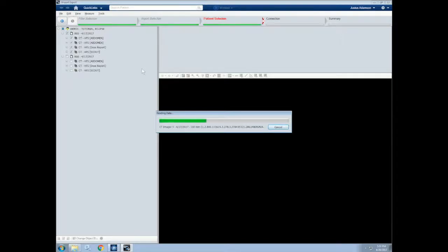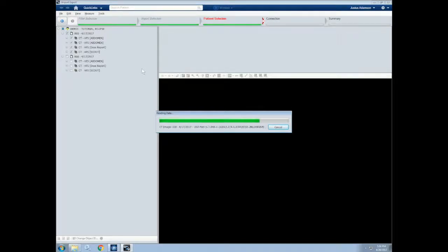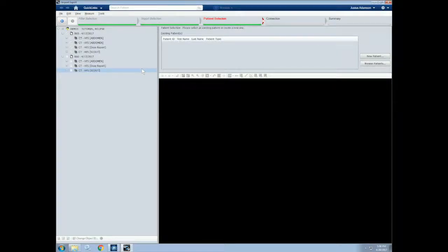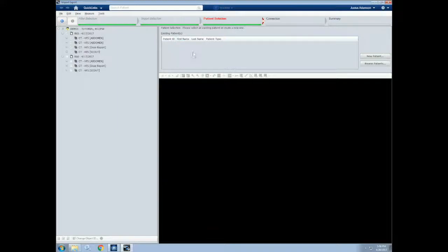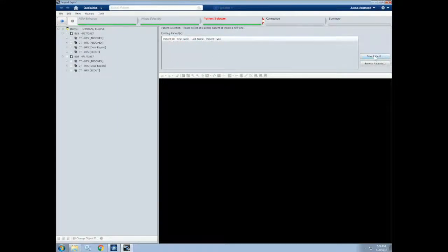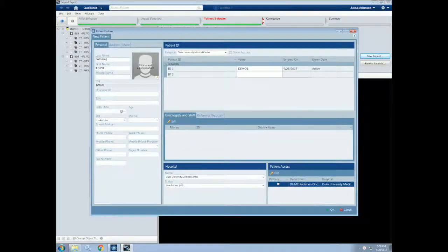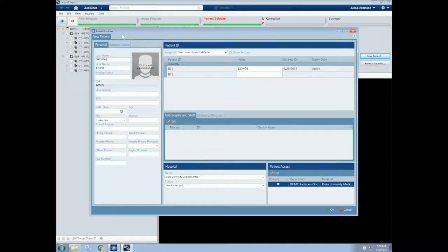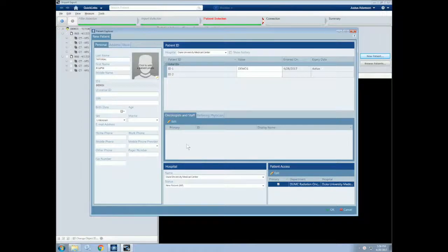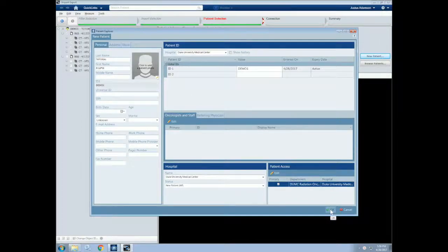For now, we'll select Series 865 that has these images associated with it. Then click Next. This will now read all of the images into the system. Once the images are loaded, we can either select a patient that would be open or in the directory or click New Patient. Let's leave all of the patient information the same as it was when the CT scan was taken. Once we have our information, we can select OK.